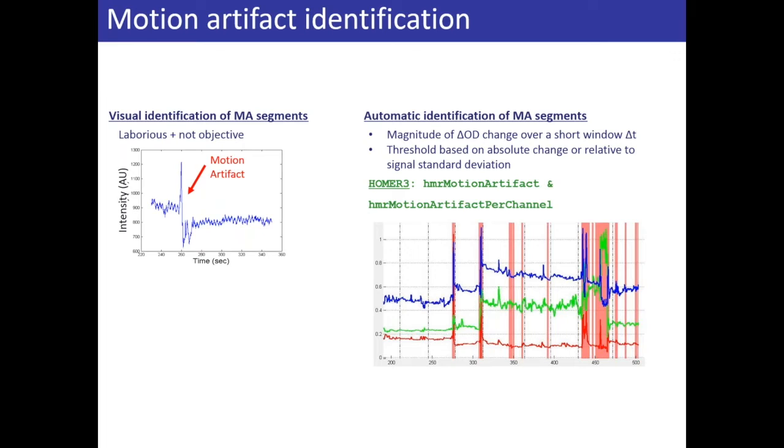What we do is we typically look at change in optical density. For instance, if the optical density change within a certain time period, for instance, 1 second, is greater than a certain amplitude, then we define the signal in that time period as a motion artifact. And generally we look for rapid changes that are much faster than physiological changes. For instance, they're much faster than heartbeat or other oscillations in the signal. We can look at either absolute change in amplitude or relative to the standard deviation of the signal. They can both work. The screenshot you see is from Homer. When you run this motion detection function in Homer, it will create red patches around the detected motion artifact, as you can see here and elsewhere.